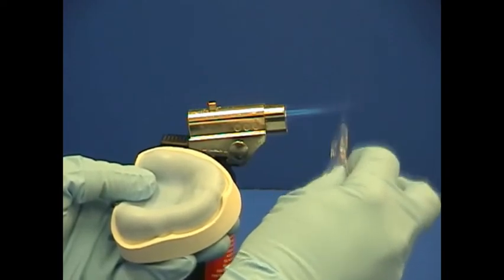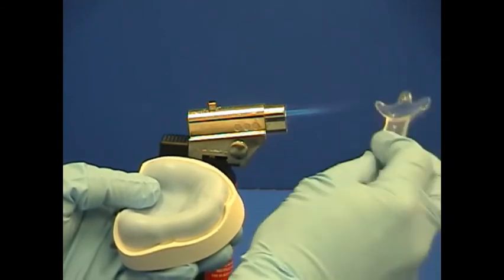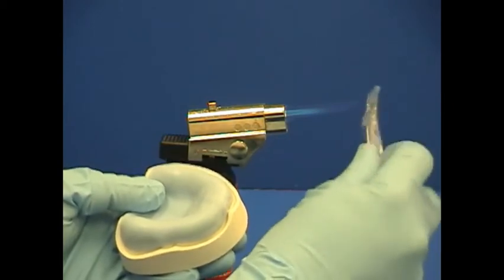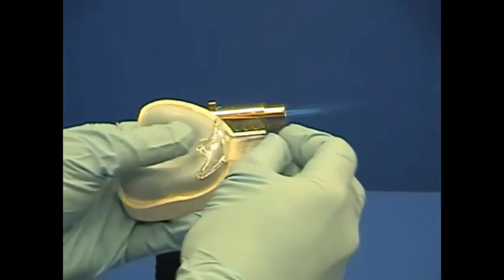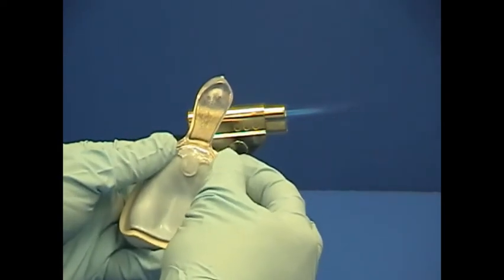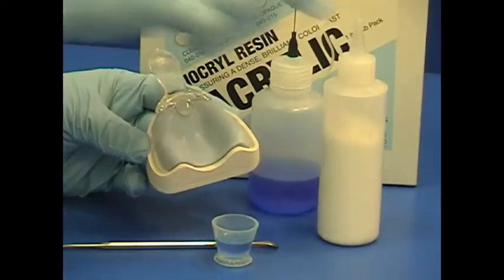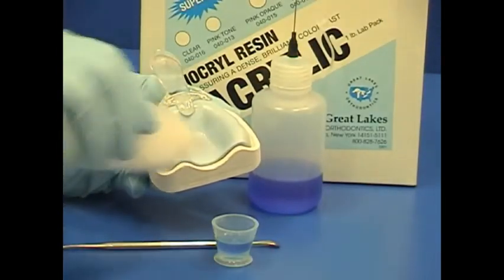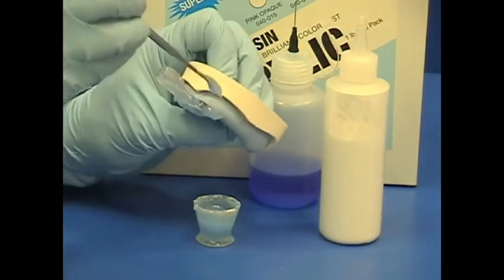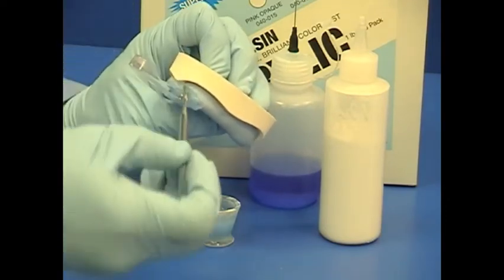Once the tray is trimmed, temporarily hold the preformed handle in position by heating the bite fork-like ends with a butane torch. Mold them to the tray using gloves for insulation, and make sure to center the tray handle with the anterior ridge of the tray on the model. Secure the handle to the tray using bioquil resin — mix monomer liquid and polymer powder to a maple syrup-like consistency, then apply the mixed resin to the handle and tray area with a spatula.